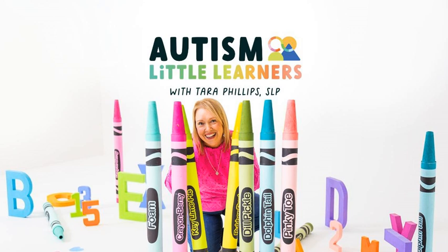Number 2, model without pressure. Don't expect the child to imitate you right away. Input comes before output. Number 3, train the whole team. Teachers, paraprofessionals, therapists, and families should all model AAC. Consistency builds confidence.